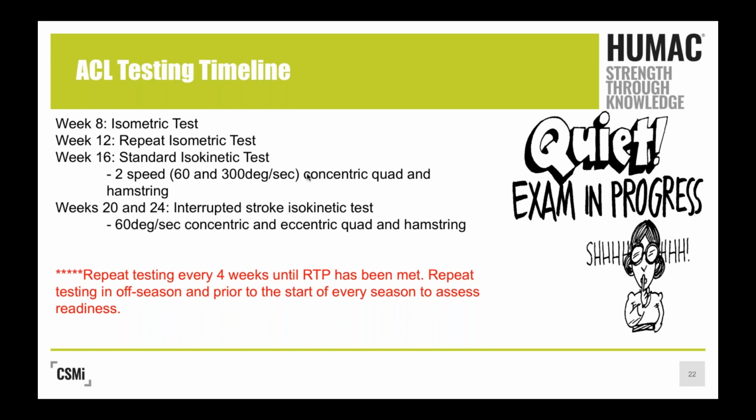At week 20, that's when I like to go to that interrupted stroke test that John's going to tell you about. We don't use it before that 5-month mark, just because when you're loading maximally eccentrically that hard, that's a lot of force that can be produced. So we hold off on that until they've gone beyond that weakest stage of the ACL, the 10 to 12 week point where everything is weak, and then they've had about a month or 2 beyond that for the graft to get more solidified in there and for them to get stronger. So we hold off on that until week 20.